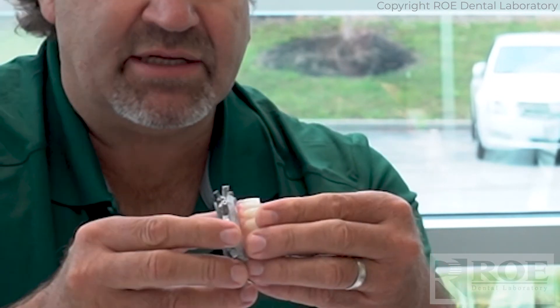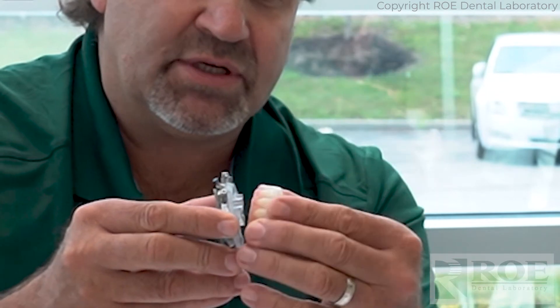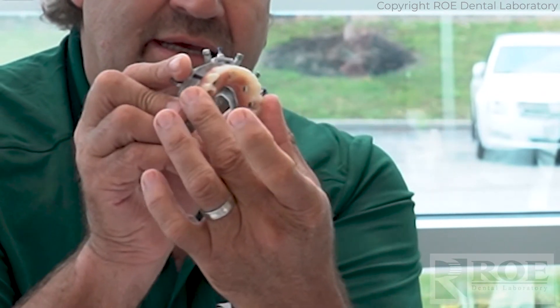After we put the temp cylinders on, we're going to put our gaskets on and our rubber dams — it doesn't go all the way down, so you put it halfway down. In the maxilla, your palatal tissue, if it's not sutured, can be in the way, so make sure it seats positively with no gap. The prosthetic has two little prongs and two holes, so the XYZ axis is 100% flush. Once it is flush, always check that the palatal tissue is brought out and the seat is 100%.